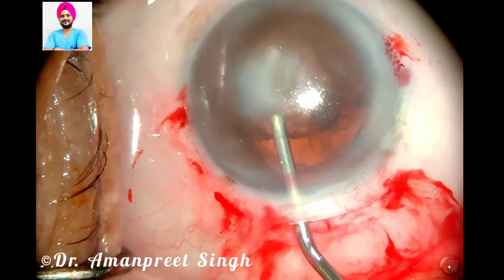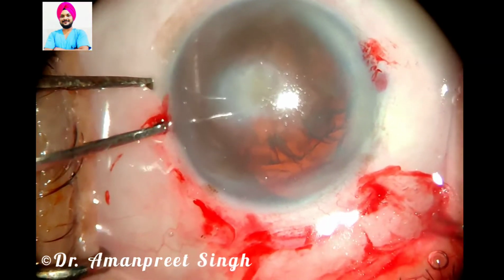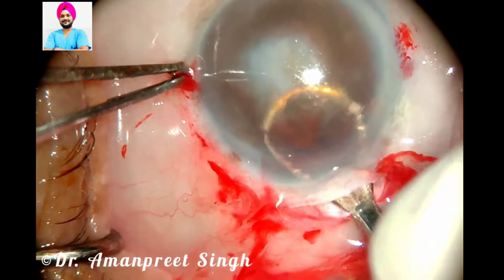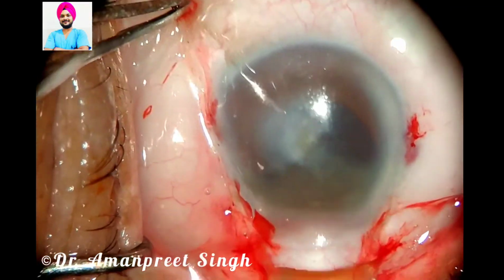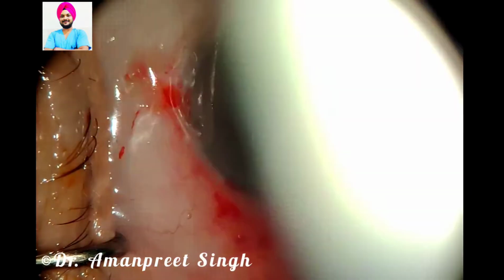Now I am using wire vectis to remove the cataractous lens. Just press the posterior lip while you are coming out, so you can express. I have taken the cataractous lens out.